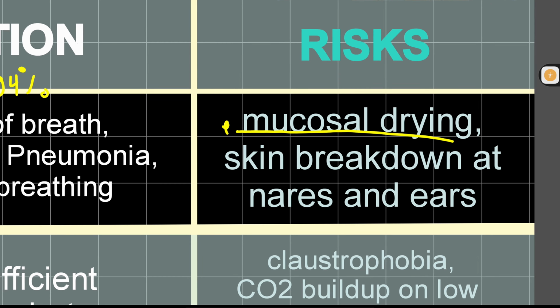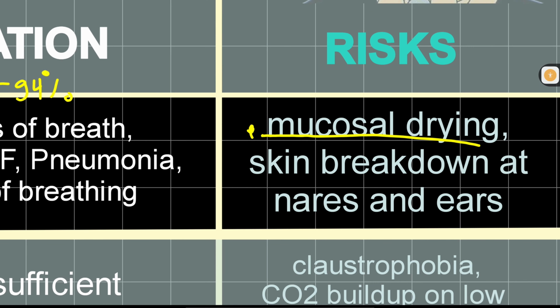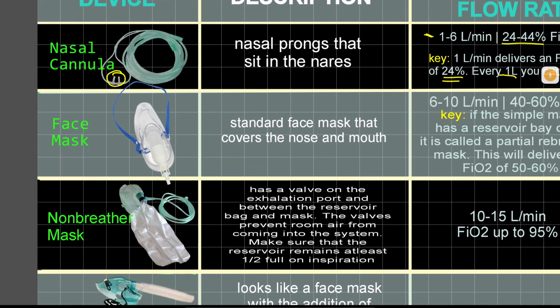which is actually irreversible. So you want to make sure that you supply not just oxygen but humidity to the patient to prevent mucosal drying and skin breakdown. Okay? All right. So we're done with nasal cannula. We're going to proceed with the next step.